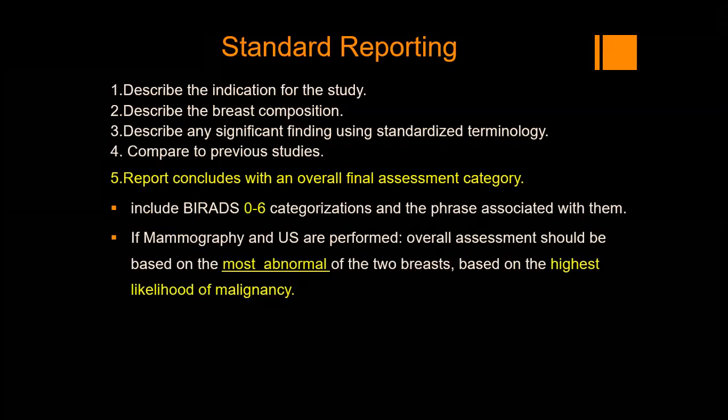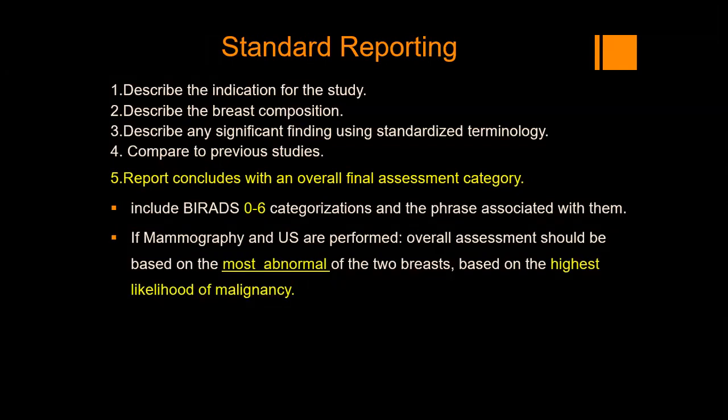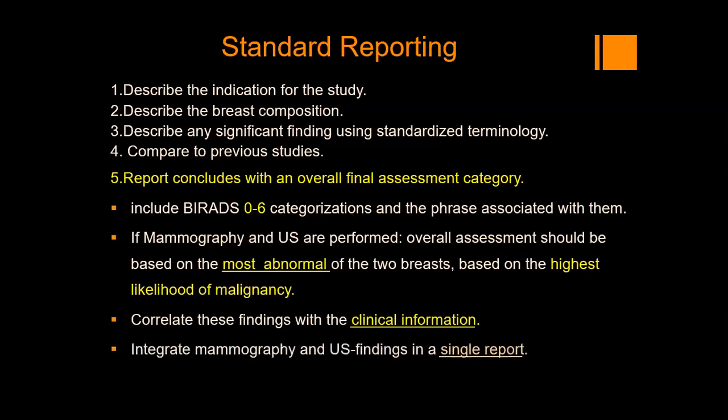BIRADS 0, what does it mean? BIRADS 6, what does it mean? If mammography and ultrasound are performed, the overall assessment should be based on the most abnormal of the two and on the highest likelihood of malignancy, the most suspicious findings. And we should not forget to correlate these findings with the clinical information and integrate mammography and ultrasound findings in a single report.